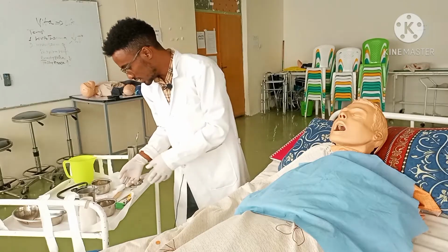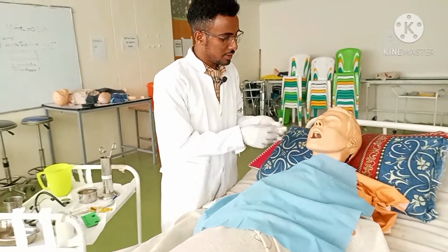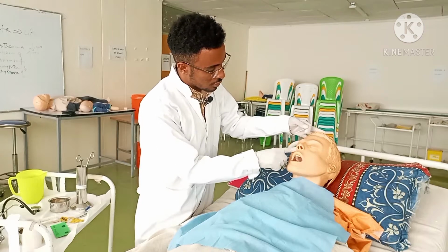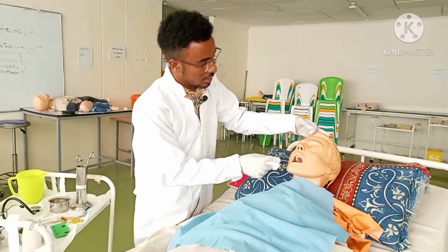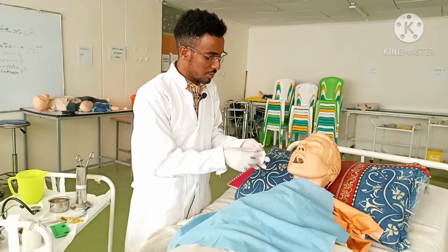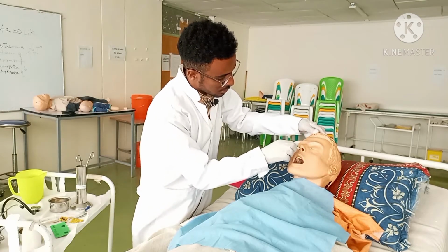After that, you have to clean the nostrils and make sure the nostrils are patent. Mr. John, I am going to check whether your nostrils are patent or not. While I am closing one nostril with gauze, you have to blow air in the other nostril. Okay, you are able to blow air. Here is patent. Close one nostril and the patient is also able to blow air in the other nostril. So the two nostrils are patent. Then you have to clean the nostrils if there is any debris. You can also use a cotton tip applicator.